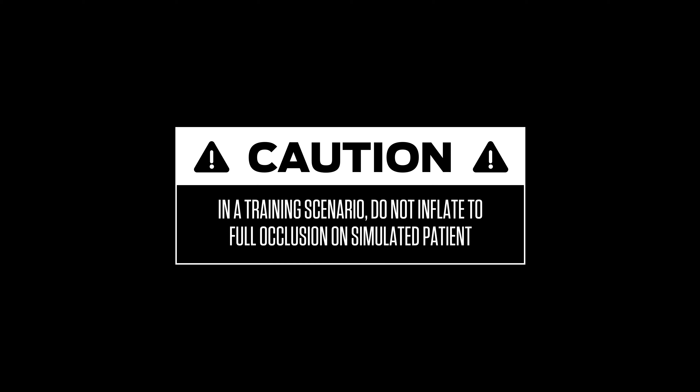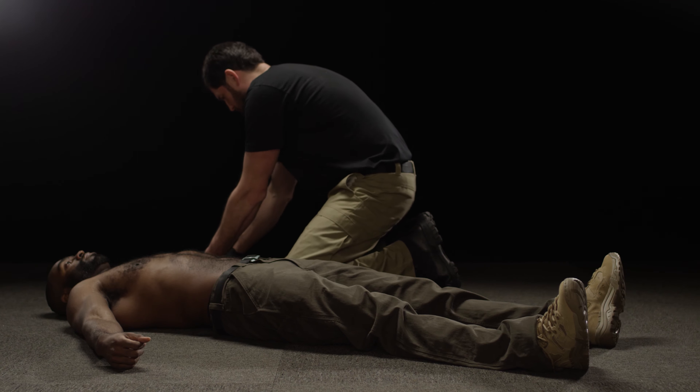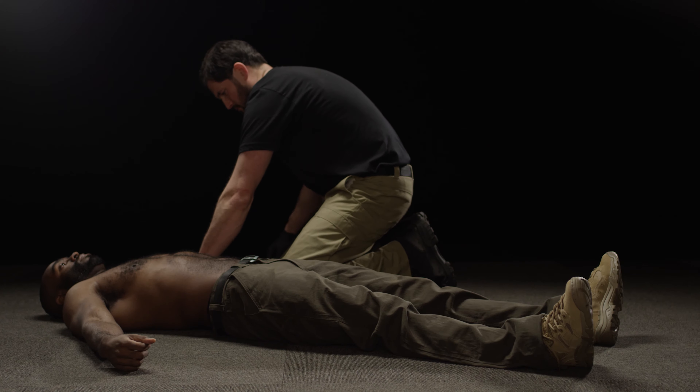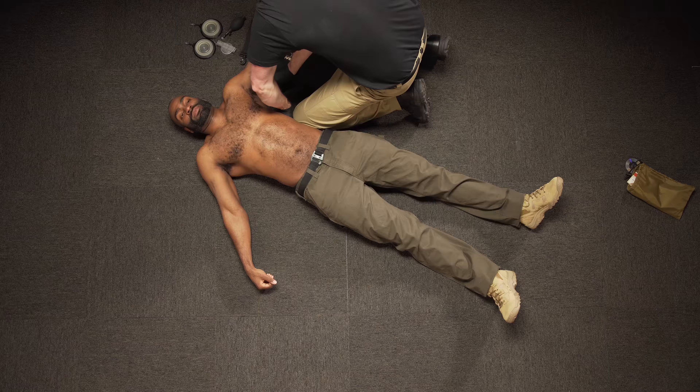In a training scenario, do not inflate to full occlusion on a simulated patient. The SJT is used to control hemorrhage in the upper arm or axilla when an ordinary tourniquet cannot be used. Before applying the SJT, your patient must first be exposed to the extent that is appropriate for the given situation.